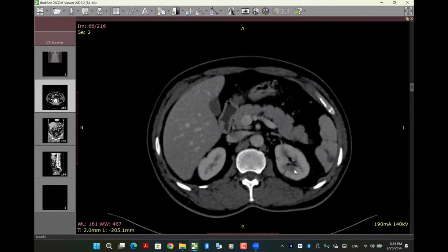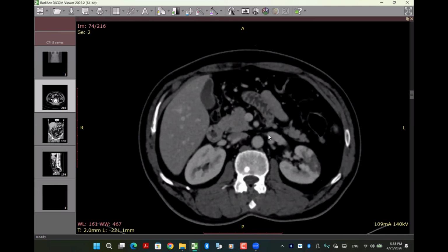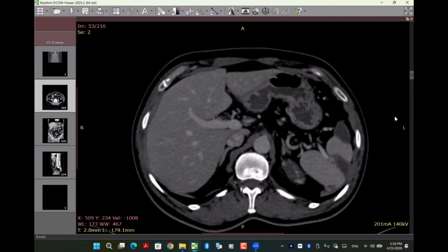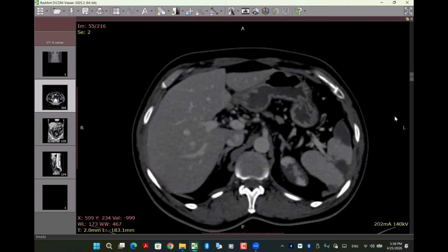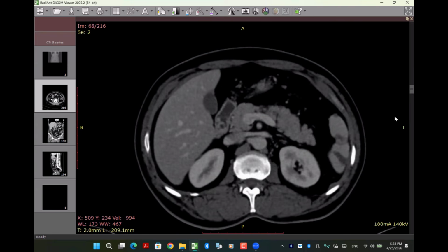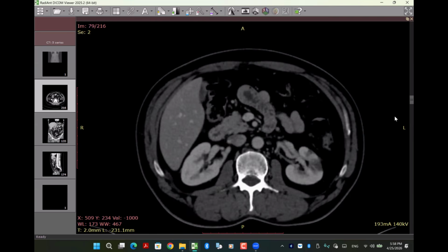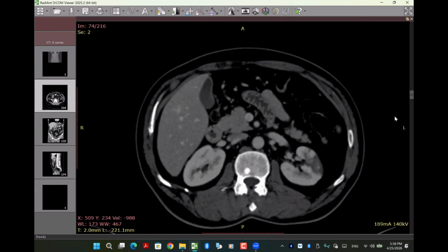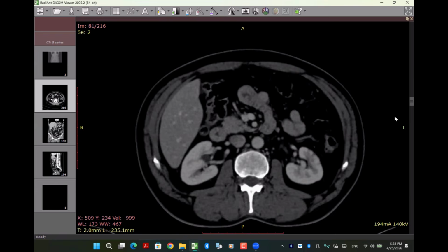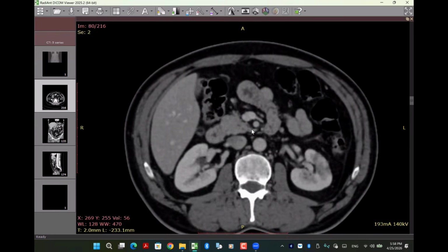Okay. So what else can you check in this scan? So I would like to check the vessels. Yeah, I would like to check the renal arteries for any abnormality on both sides. So I will come to the region of renal arteries at the level of hila. So the renal artery on the left side appears patent. Can I check it in... it is patent. Renal artery is. Yes. Both of them are patent. Okay. Just to save time, you described it very well.